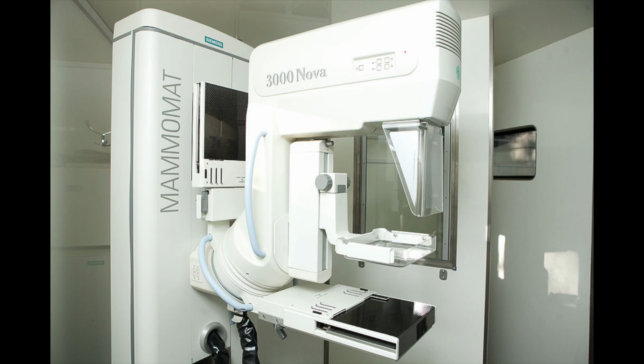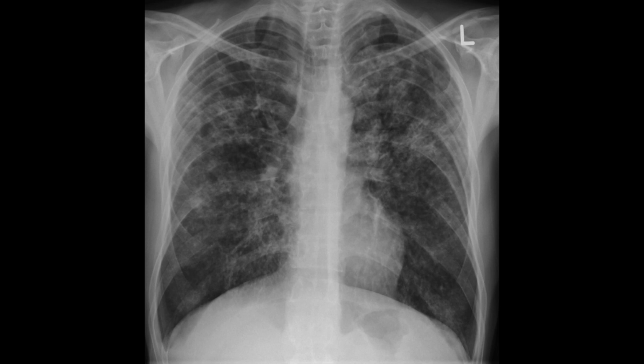Beyond creating images of bones and foreign objects in the body, X-rays have a few other uses. They're also used to detect abnormally dense tissue, so they're used by mammography machines, and they're also used to detect tuberculosis nodules or tubercles, as depicted here.